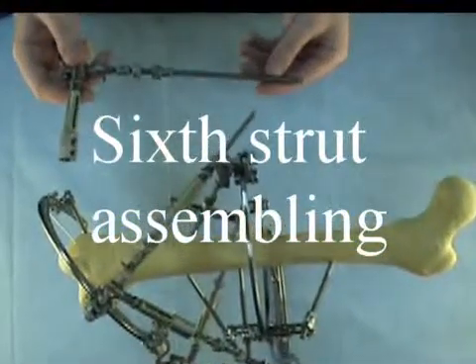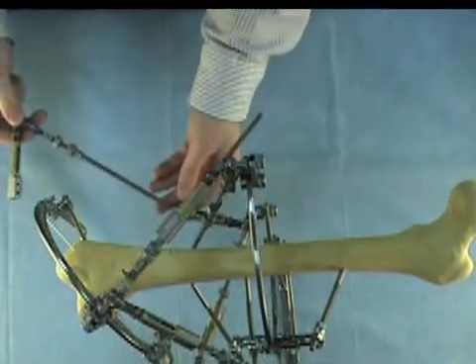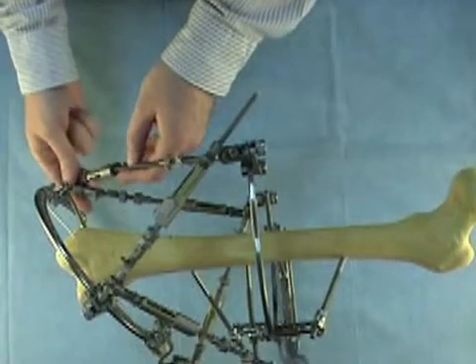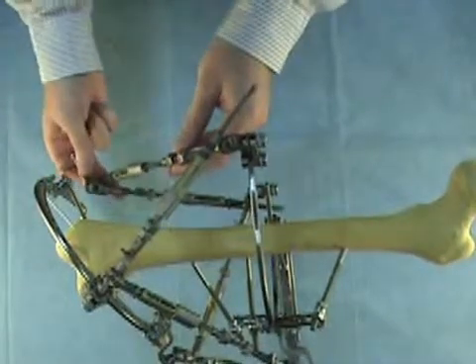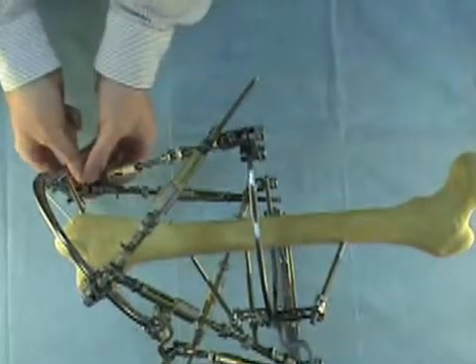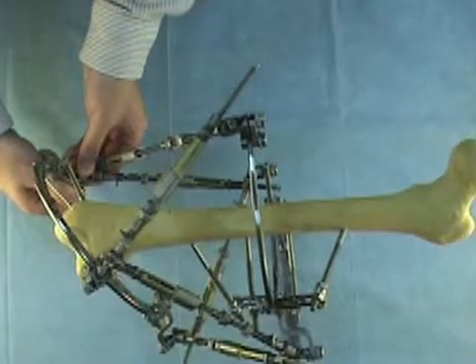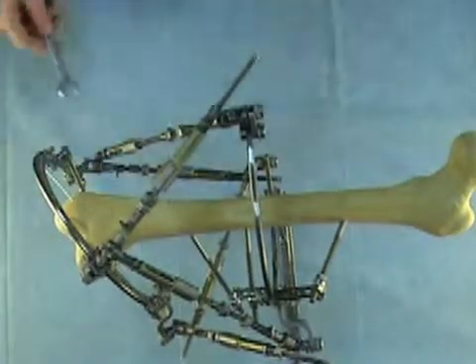Now we attach strut number six to the distal ring. We have enough space to fix the strut directly to the ring. First we insert the threaded rod of strut six into the strut length changing unit of strut number five. Then we insert the threaded rod of the first strut into the strut length changing unit of strut number six. Then we insert the threaded tail of the joint of strut six into the hole of the ring, fix it by the nut, and tighten this connection by 12mm wrench.